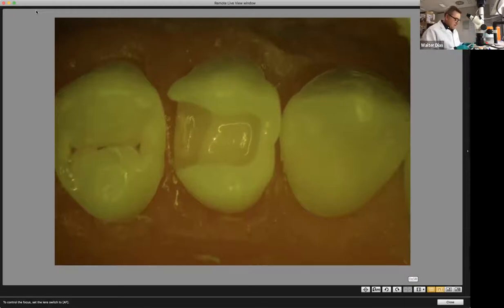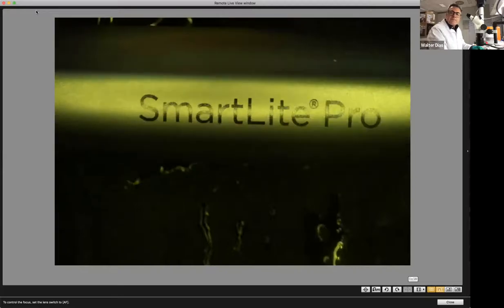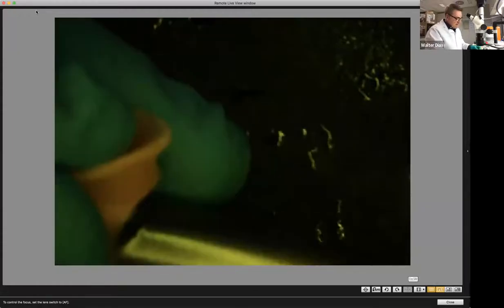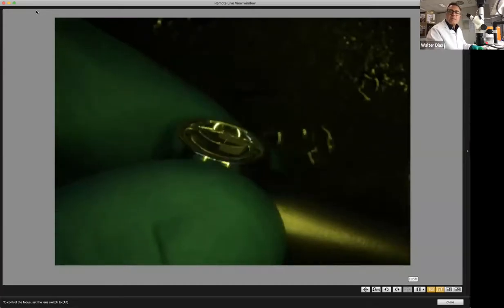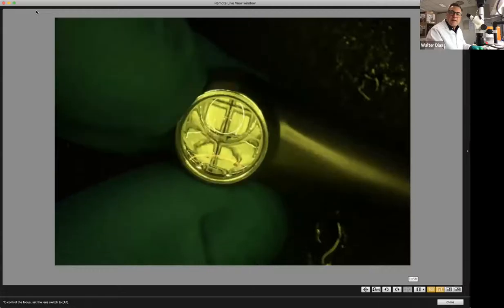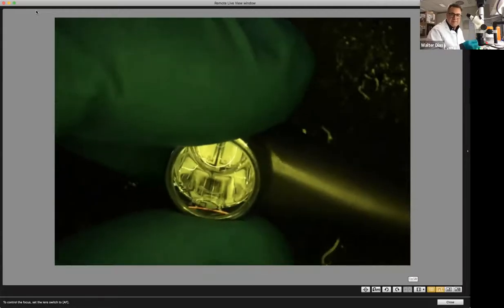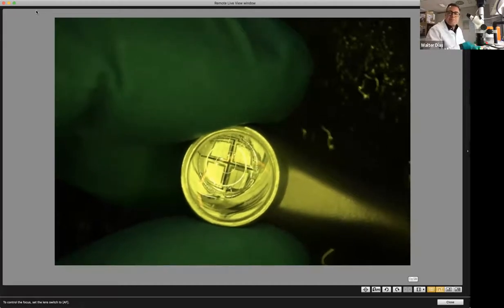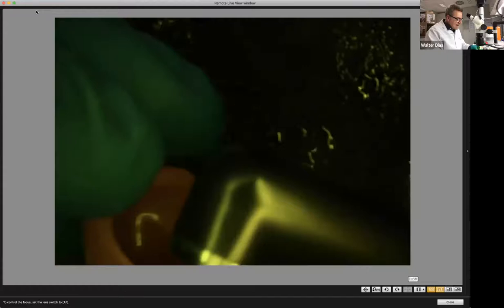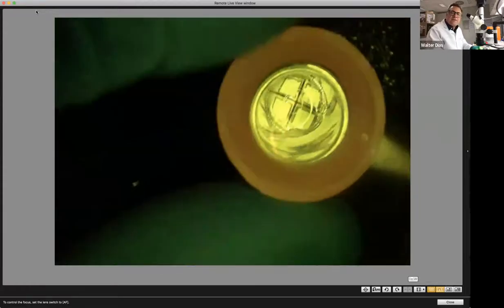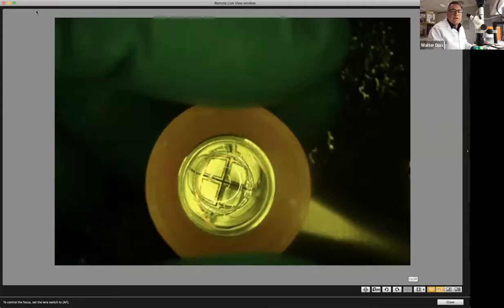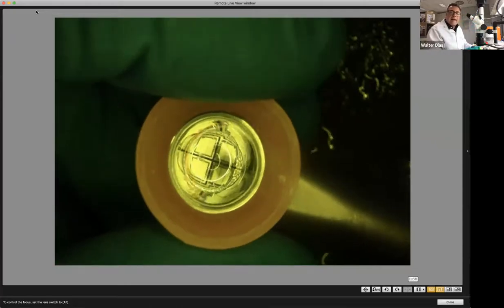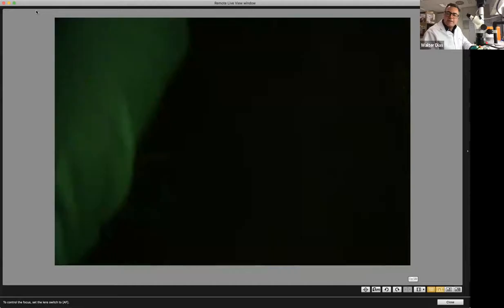Now we light-cure this using a very good light. This one is the Smart Light Pro — the new light from Dentsply. It has four blue LEDs with collimated lenses. It's so powerful that Dentsply actually had to chip it and decrease output via software because it was burning teeth — it can easily reach 1,500 milliwatts per square centimeter. It will certainly deliver 800 milliwatts at an eight-millimeter distance.